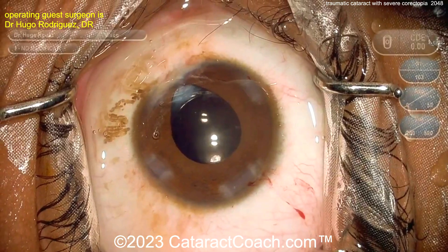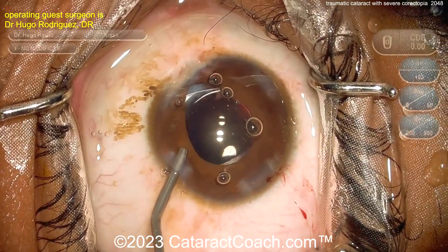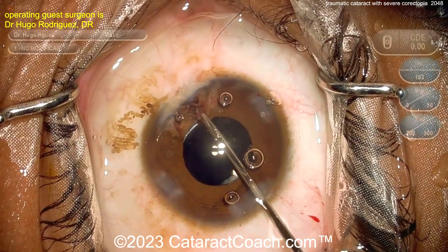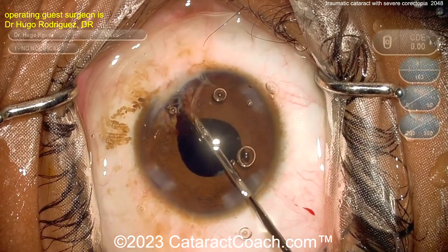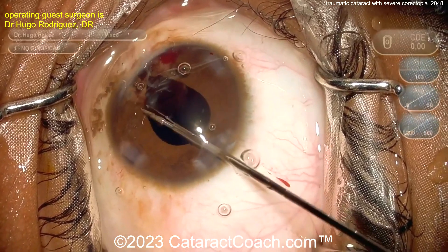At the end of the cataract case, what are you going to do to address the corectopia and the irregular iris? It looks pretty good on the OR table, but once the mydriatic agents wear off the pupil will still be significantly decentered. So here, pulling out that iris tissue carefully — being careful not to disinsert it from the iris root.